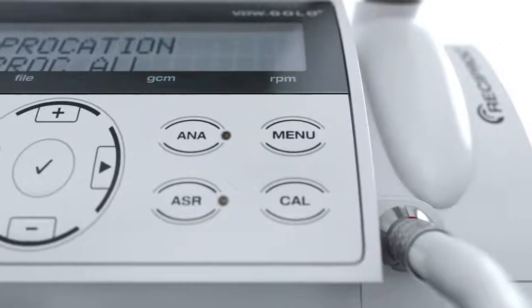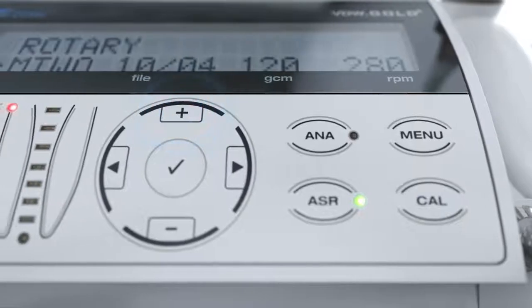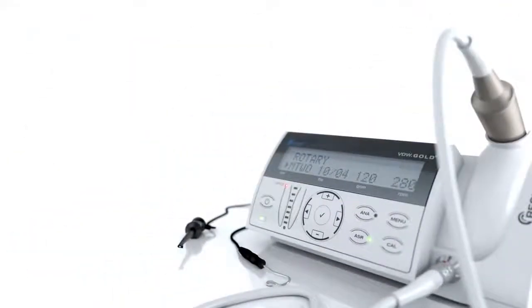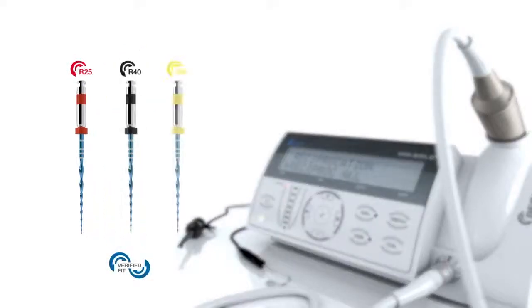You can pre-select a file system with the help of the navigation pad. The VDW Gold Reciproc incorporates the reciprocating file system Reciproc and Reciproc Blue from VDW, as well as all major rotary nickel titanium file systems.